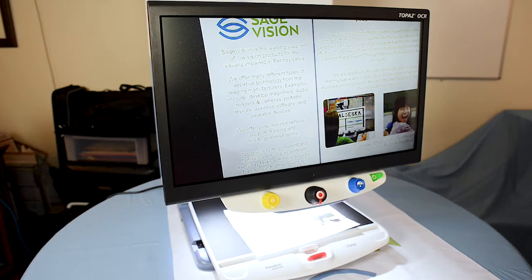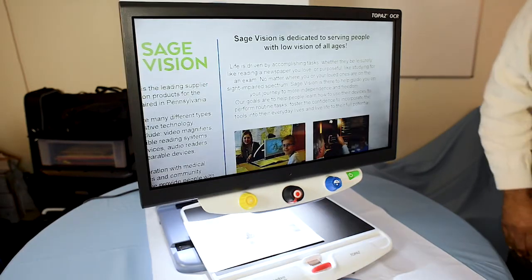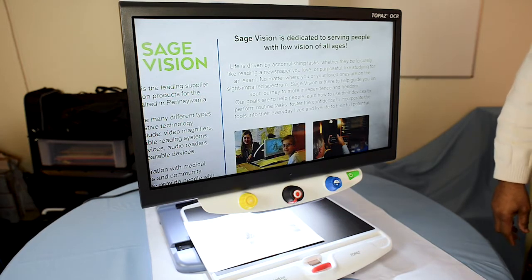Another great feature is the OCR feature. OCR stands for optical character recognition. This is great for if you don't want to read a document with your eyesight — you can have the document read aloud to you.